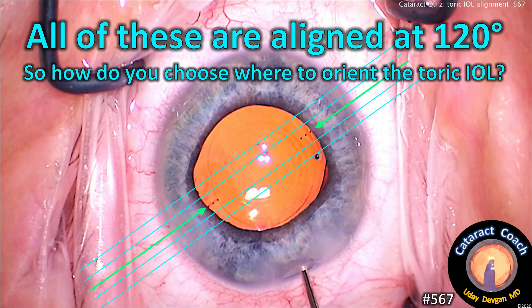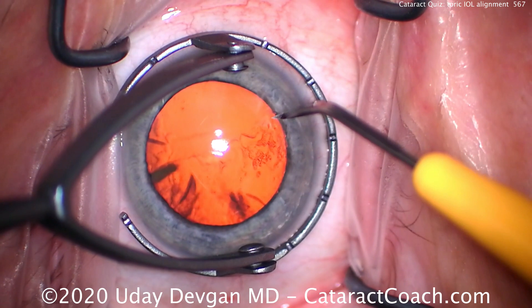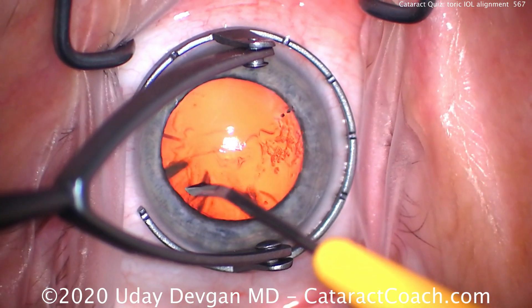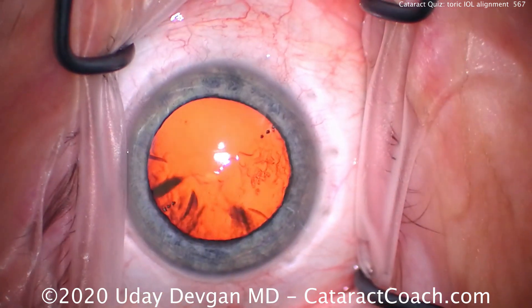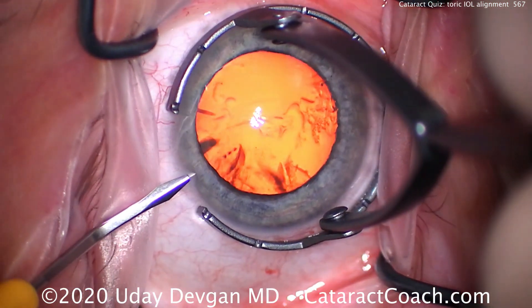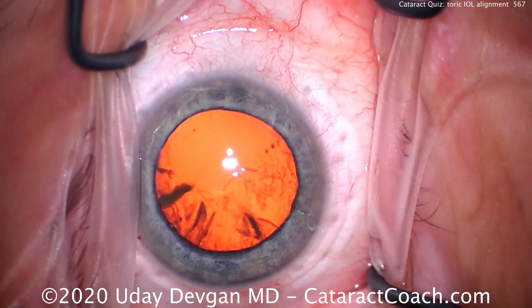From cataractcoach.com: all of these marks are aligned at 120 degrees, so how do you choose where to orient your toric IOL? It's a great question. We're making marks here at the 120-degree meridian, and confirming this with an intraoperative guidance system, which you're not seeing here on the microscope view. We're going to make the paracentesis there at that steep meridian.